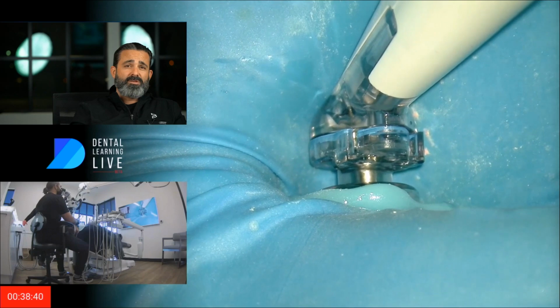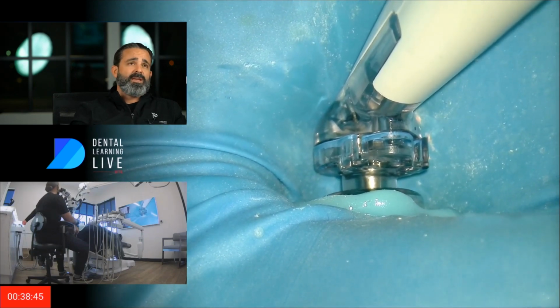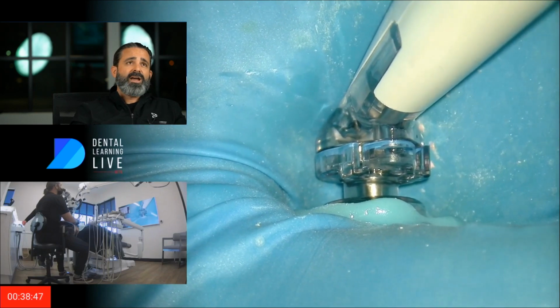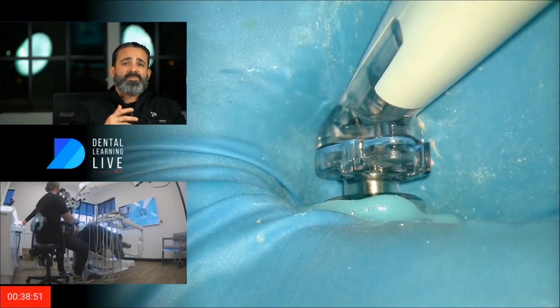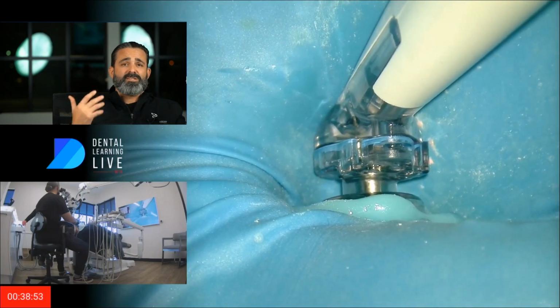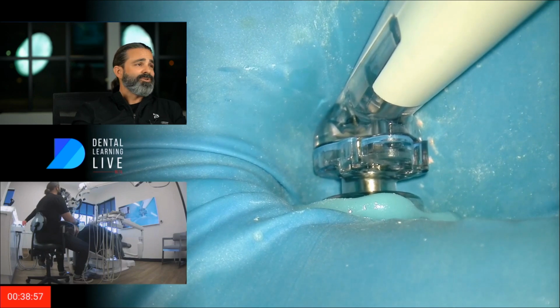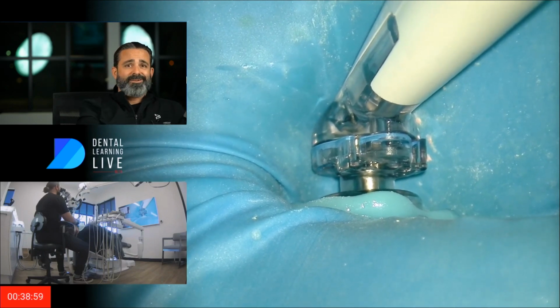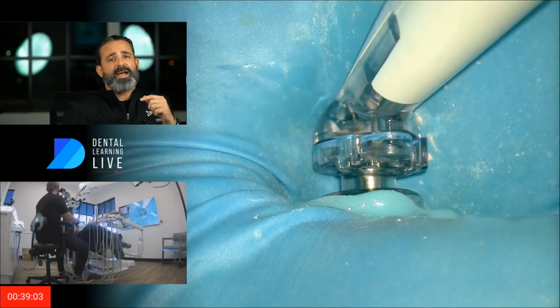The more that I do this, the more I realize there is feedback in that. And we get haptic feedback. We learn from the sound changes. We learn from changes. But we're human beings, and sometimes we get distracted. We might see something run across the room, or, you know, squirrel, and look over there, and then not pay attention to what we're doing. And you'll see that happen here.